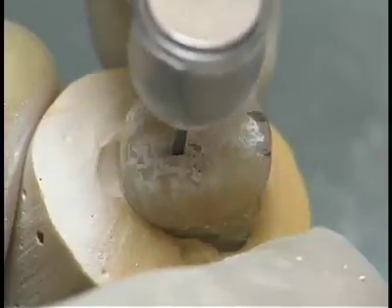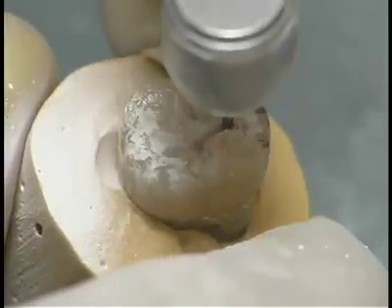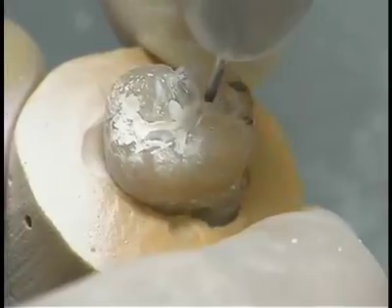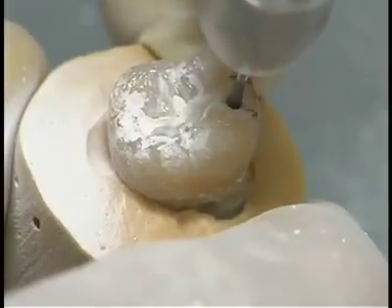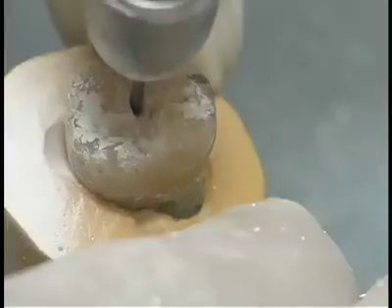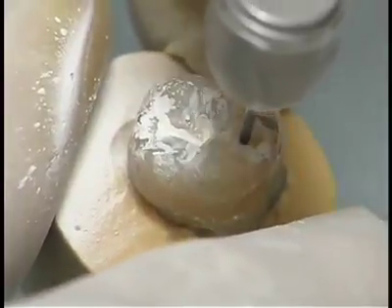Begin the occlusal segment of the tooth preparation by entering the deepest or most carious pit, orienting the burr 90 degrees to the occlusal plane. The burr should be rotating when it is applied, and it should not stop rotating until it is removed from the tooth. As the burr enters the pit, establish the initial outline form by extending the external walls to sound tooth structure and by thinning the defective marginal ridge as much as possible.